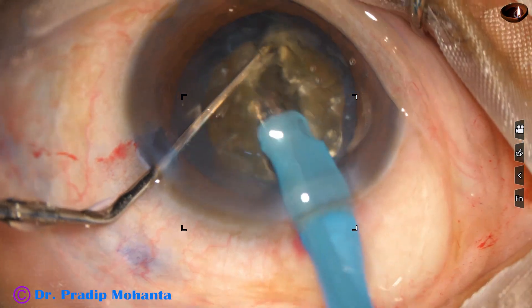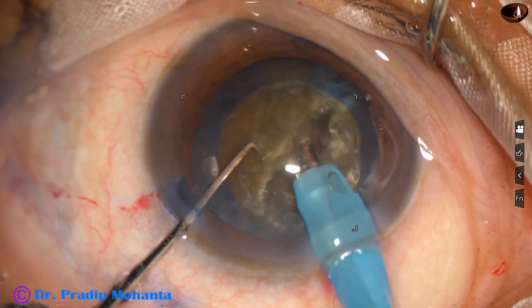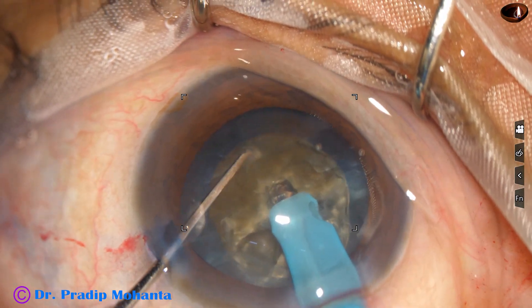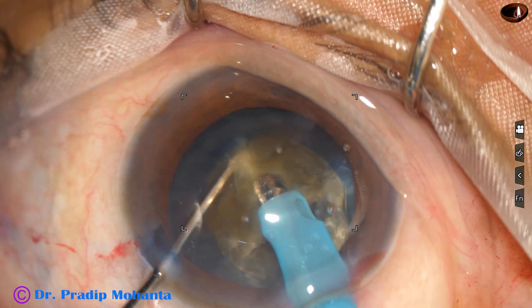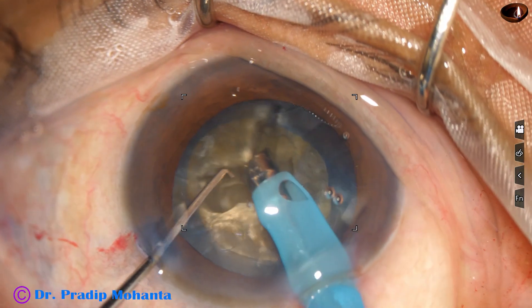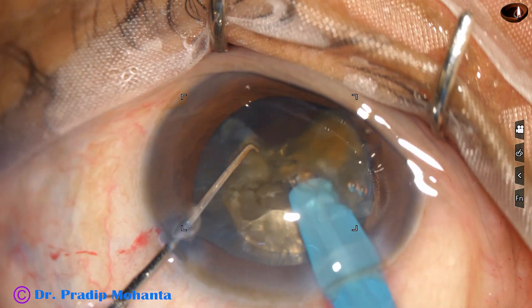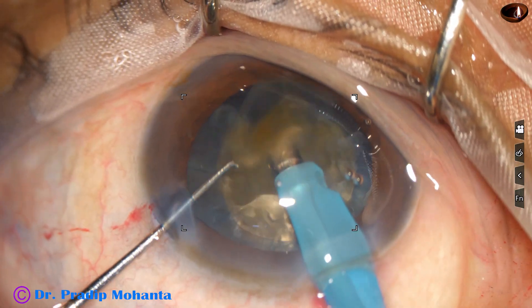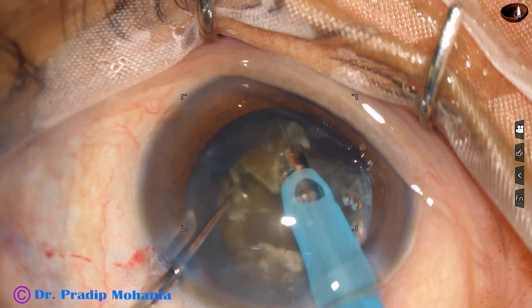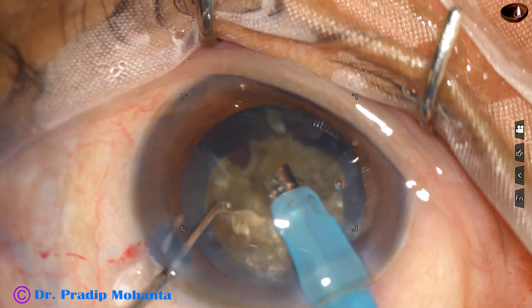Then the chopper is used to get a very good crack. In this case, I didn't rotate 180 degrees — I rotated 90 degrees and made another chop, and then one more. Here I got a free nuclear fragment and emulsified it. Then I held this small piece and emulsified it also.